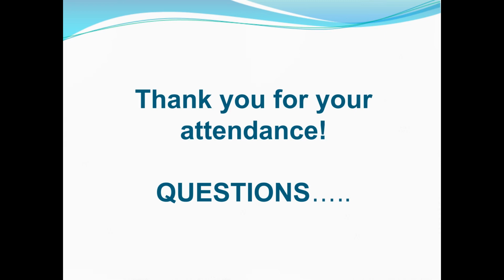Does your lab use any sequencing assays for ID? For example, in those cases where the MALDI is not adequately discriminatory? So the only reason we would have a discriminatory result would be if it's lower than 1.8. So if it is lower than 1.8, like I discussed in the presentation, we would do an extraction. If the extraction didn't work, then we would put it to our molecular instrument. So at that point, if we don't get a result from that either, then we just leave it in as a gram stain result and we wait for the organism to grow the next day.